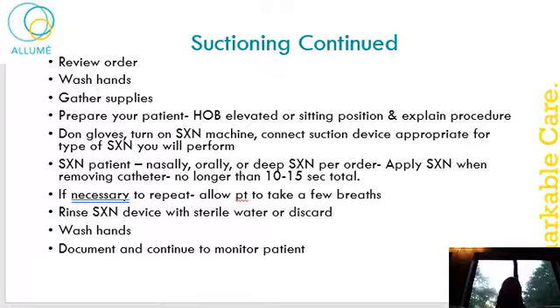You need to rinse the suction device with sterile water or discard when you're done. Wash your hands, document, and continue to monitor the patient. Make sure you're documenting every time you suction, and then of course document what you see. What is the consistency, color, and is there any odor? Because we always want to be watching our patients for an infection.